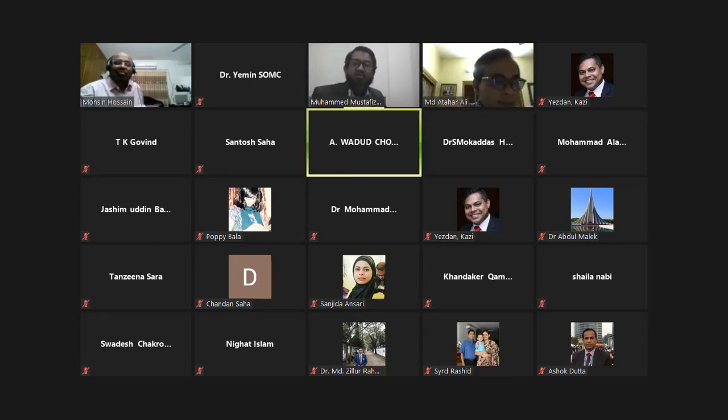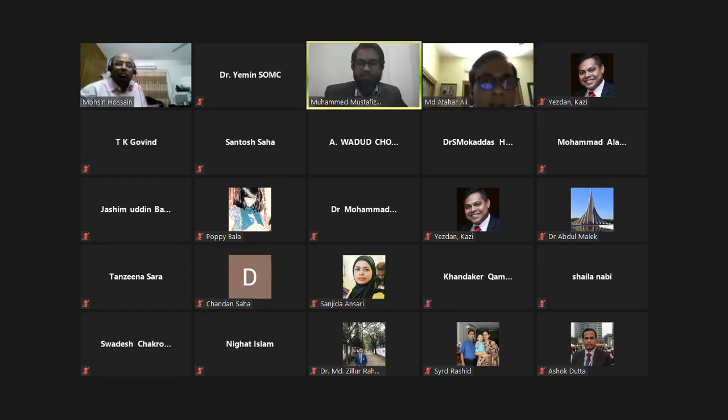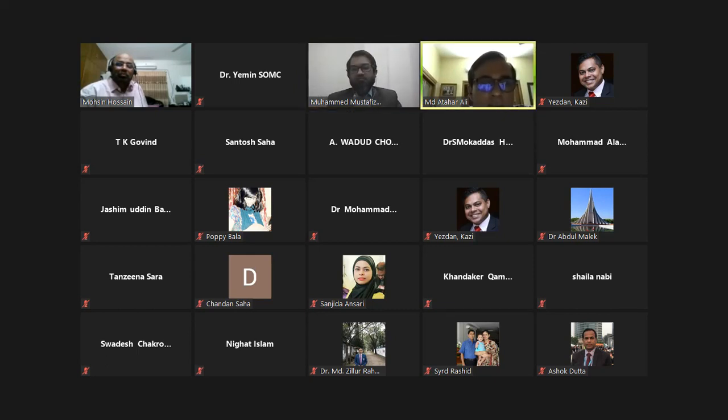Hello? Sir, you are audible, sir. Yes. Now, this is the message for our participants, thanks to Dr. Sadi Bhai that he has also contributed. Like all re-entry tachycardias, AV nodal dependent re-entry tachycardia, PMT is also an AV nodal dependent re-entry tachycardia. So carotid massage and any AV nodal drug like adenosine, that is the way we treat AVNRT or AVNRT-like tachycardia. So these drugs also work to terminate the tachycardia, but yes, the tachycardia may restart again. That is the problem. So PVARP programming is the final solution. But for immediate management, carotid sinus massage or AV nodal blocking drugs work the same way as in AVNRT or AVRT. PMT is a kind of AVRT.